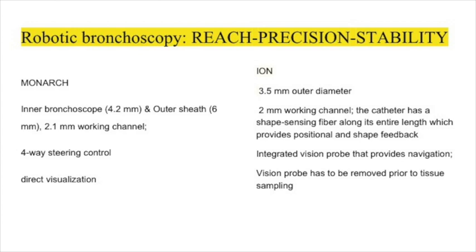So far, there are no data to see if there's a big interference between the cone beam CT scan and the field generator, but based on my personal experience, the virtual target can change location by a few millimeters up to a centimeter or 2 centimeters, depending on the location of your field generator and the cone beam CT scan. So technically, during the navigational phase, I try to keep the cone beam CT scan away. I use the mobile cone beam CT scan, and I keep it away at least about 3 feet.